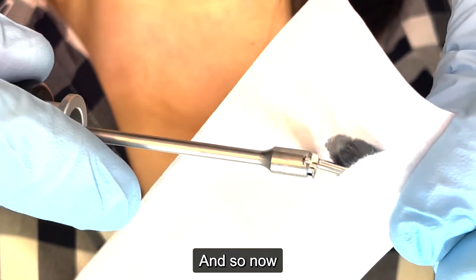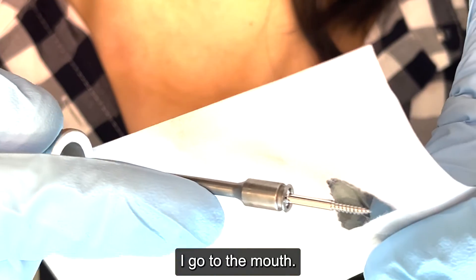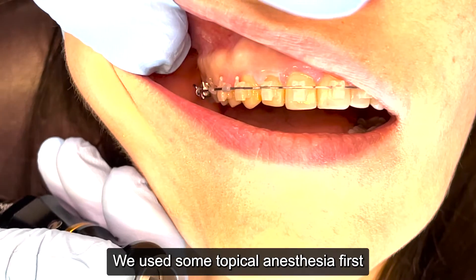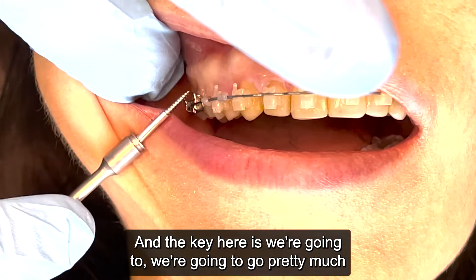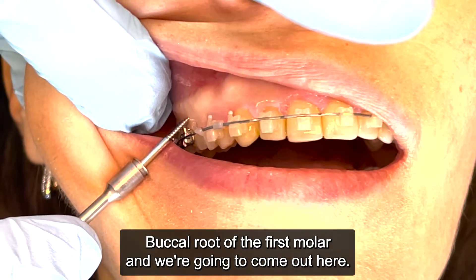Now we go to the mouth. We already got the patient numb — we used some topical anesthesia first, followed by some local anesthesia. The key here is we're going to go pretty much parallel to the mesiobuccal root of the first molar.